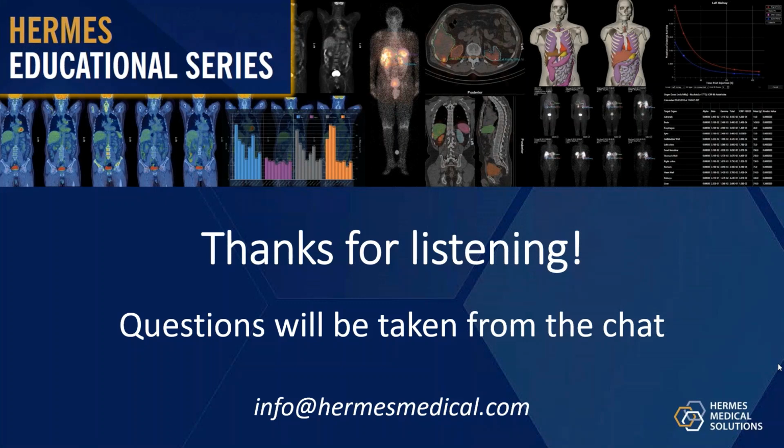Maybe that is one of the goals, but that is still probably not the clinical reality, not just yet, because there can always be cases where you don't have any teaching material available for your deep learning network. But I know that, for example, people have combined the statistical reconstruction methods and the deep learning networks for noise reduction pretty much in the same way as the Bayesian methods do, but those are not yet clinically available.